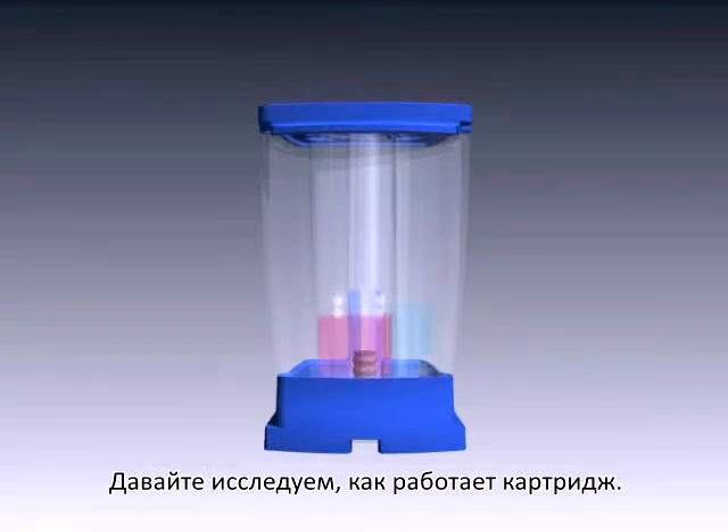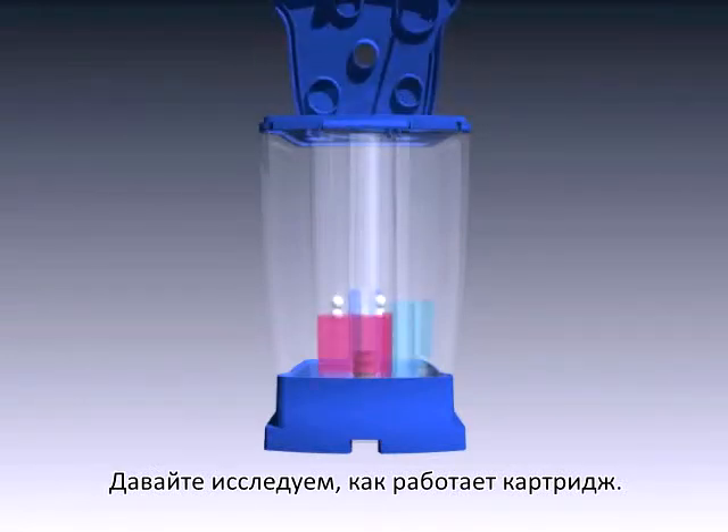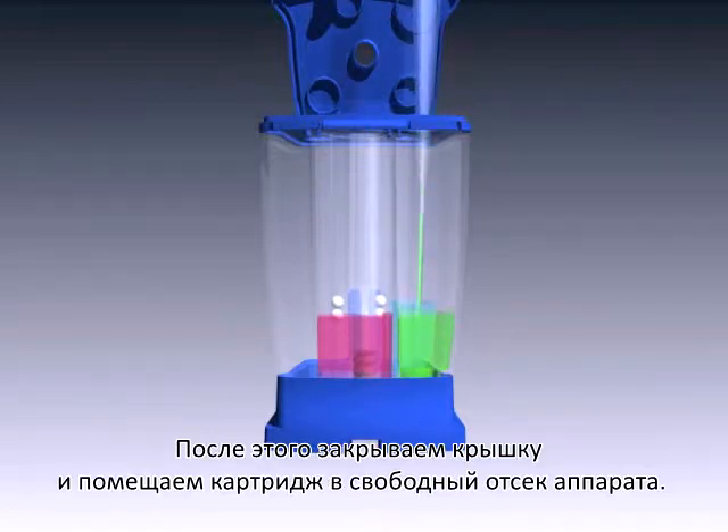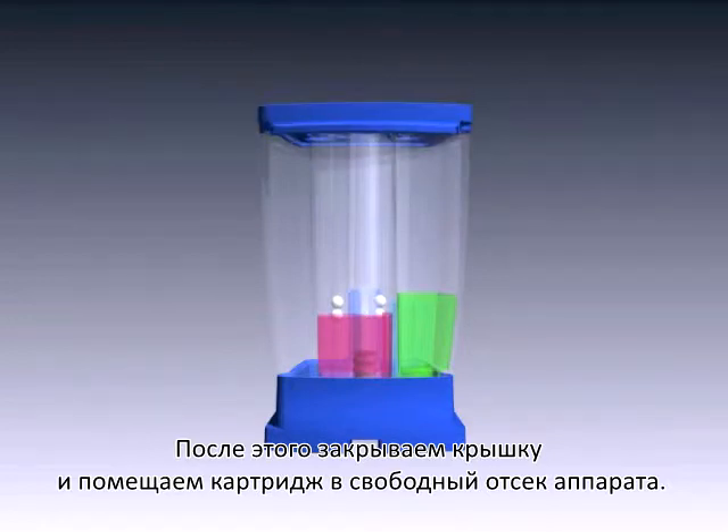Let's investigate how the GeneXpert cartridge works. First, pipette your sample into the sample area of the cartridge. After that is done, close the cap and place the cartridge into an empty bay in the instrument.